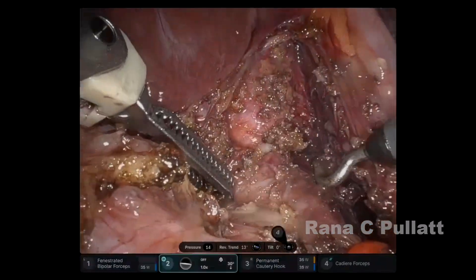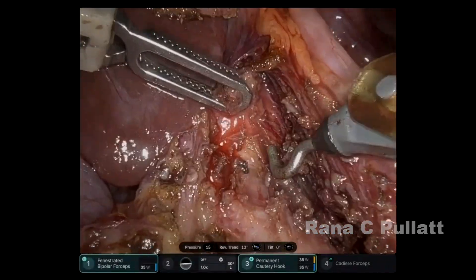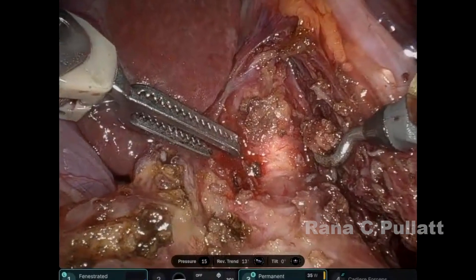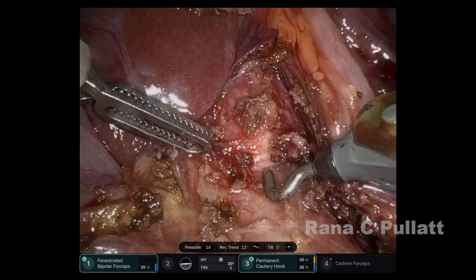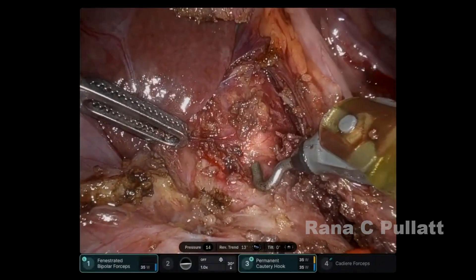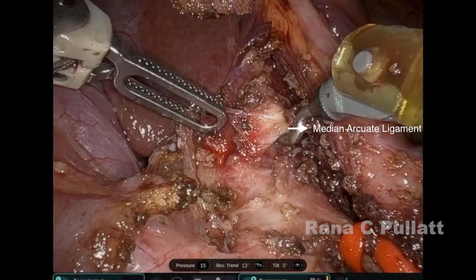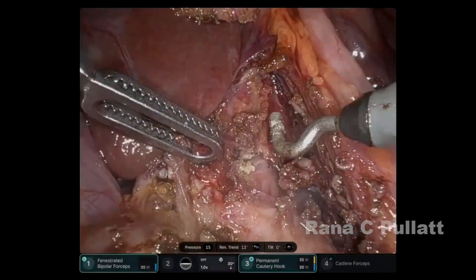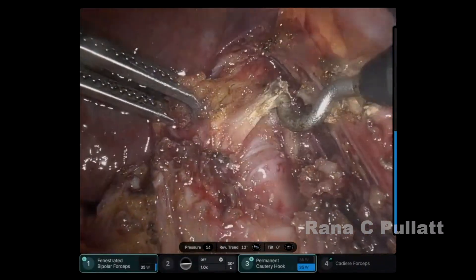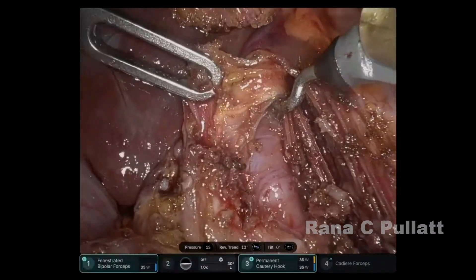Clearly coming into view is the shiny, compressing median arcuate ligament. As can be seen in this video frame, a lift test is then performed to confirm that this is the median arcuate ligament. A protected hook would be a much better option here, but the median arcuate ligament is divided and the post-stenotic dilated celiac artery is seen.